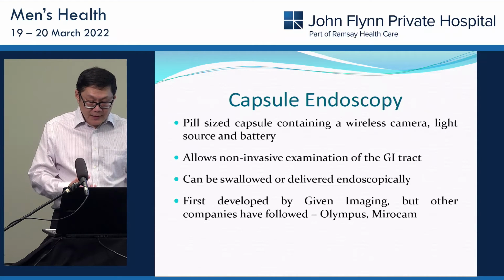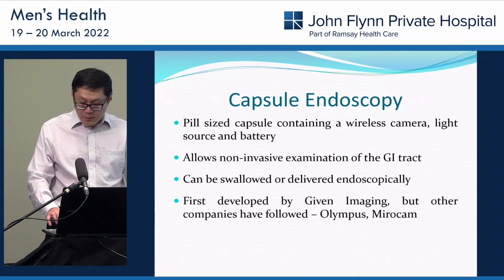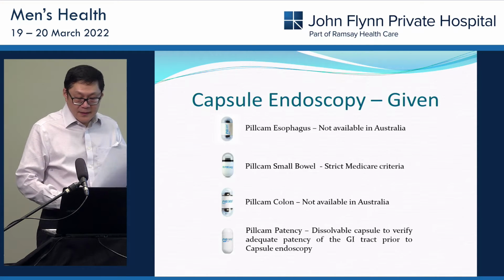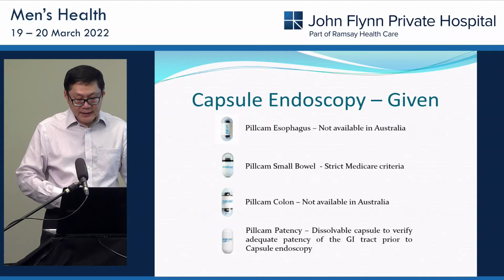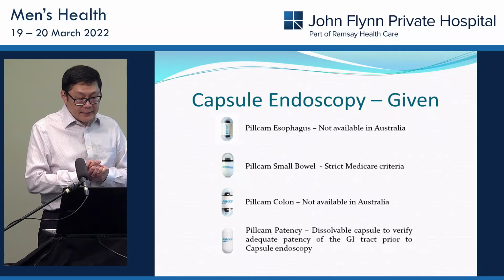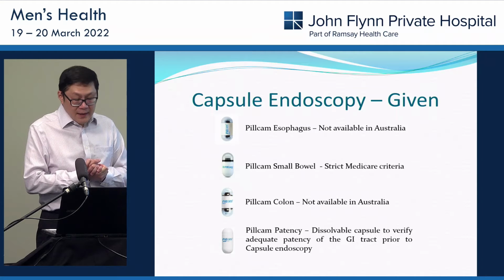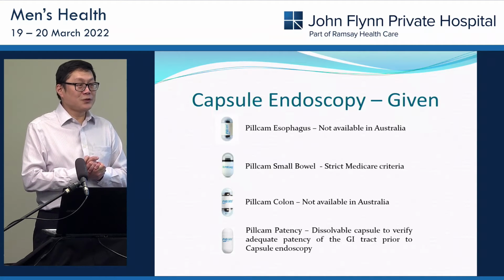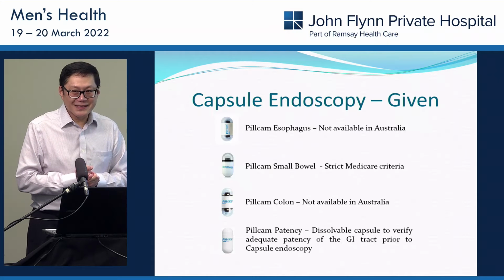It was first developed by Given Imaging, but there are other companies who have joined the race. With the Given capsules, there are a number of different ones, but the only one that is available in Australia under Medicare is the PillCam small bowel. The PillCam colon, although it sounds attractive, is completely the opposite.